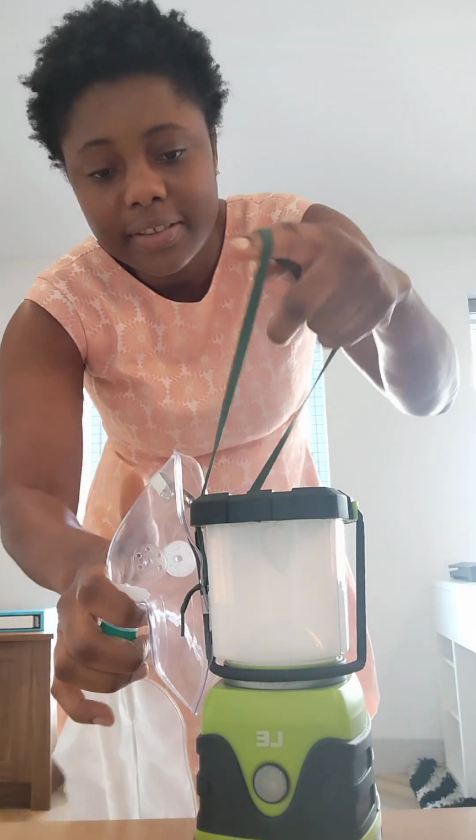Okay, so Jenny, I'm going to attach this to your nose and mouth and put this strap at the back of your head. Okay, I'm also going to adjust the nose brace and pull the strap so you become comfortable. Is that okay? Alright. So this is how you go about it. Then you put this at the back of the head. I don't have a patient, so I'm using this.